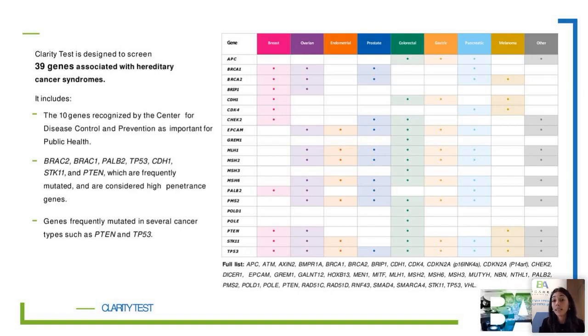So to sum up, as I said, the intention of this test is to check for germline mutations in patients that, even if they do not actively suffer from a type of cancer, might need to know whether they are at risk of ending up suffering a cancer.